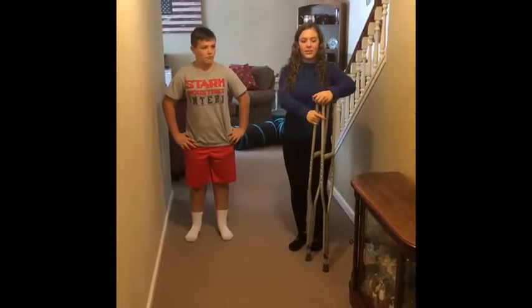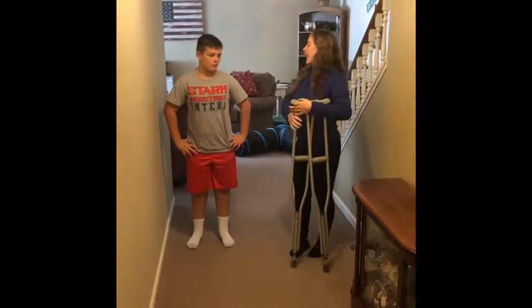Today I'll be demonstrating how to fit crutches for an injured patient. How tall are you? Five one.